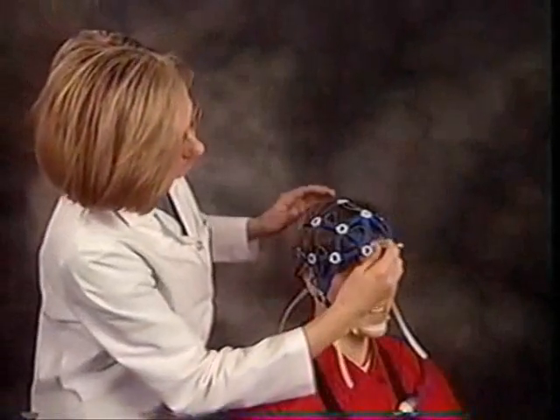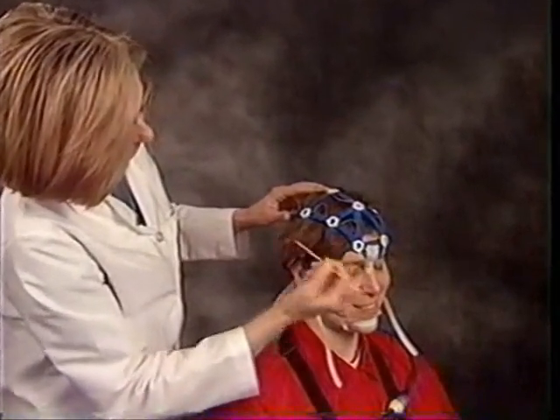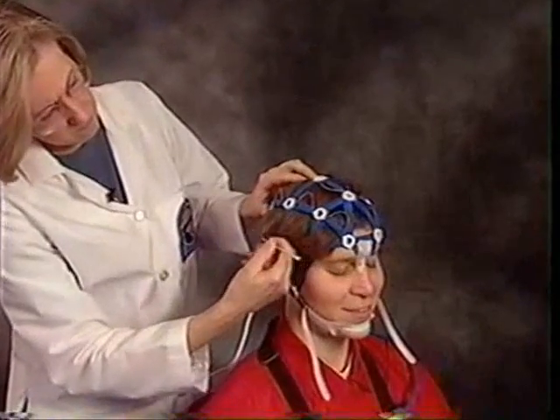I'd like to spend some time showing you the different techniques for applying the Enet on different hair types. For medium to shoulder length evenly cut hair, apply the Enet, first parting the hair along the midline if necessary.